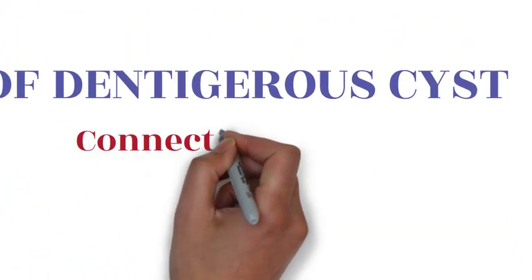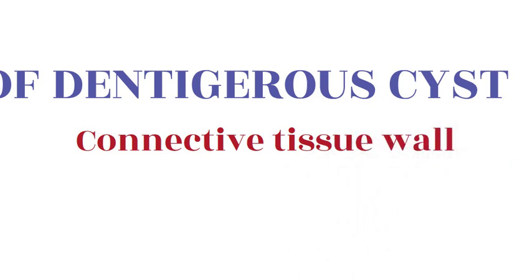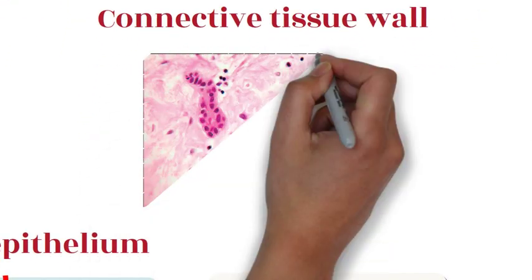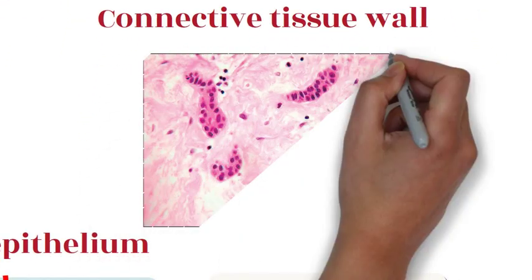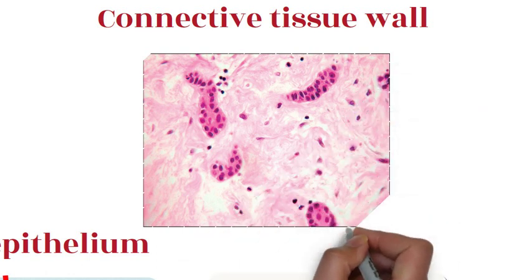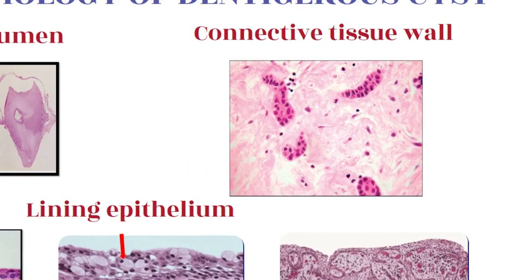The fibrous cyst wall is derived from the dental follicle and exhibits fibroblasts separated by a stroma rich in acid mucopolysaccharide. There is also evidence of nests or strands of odontogenic cells in the connective tissue wall.